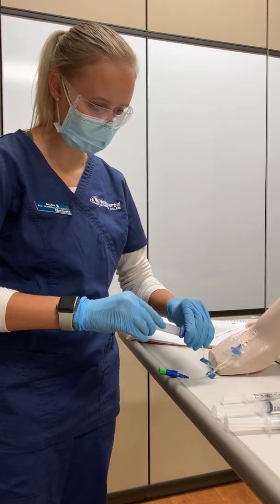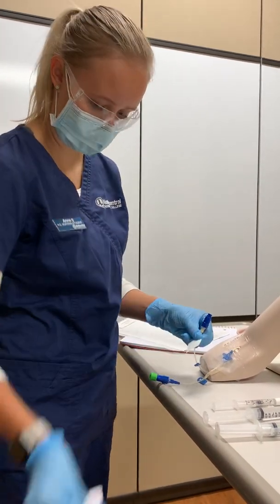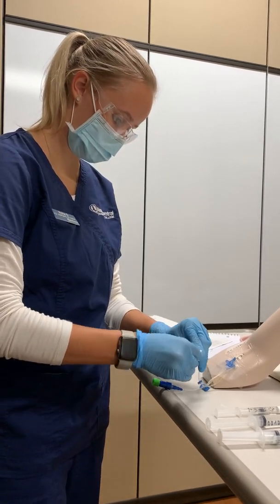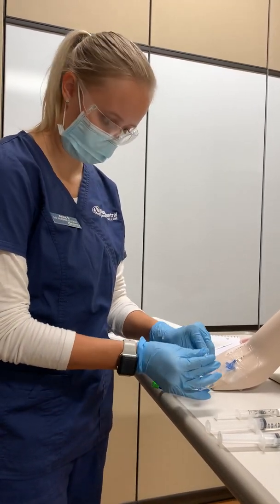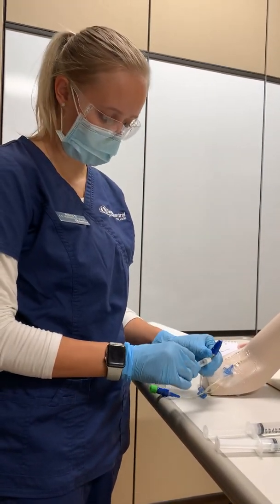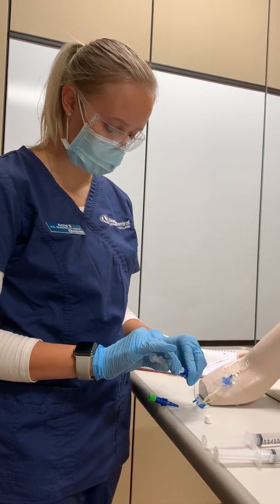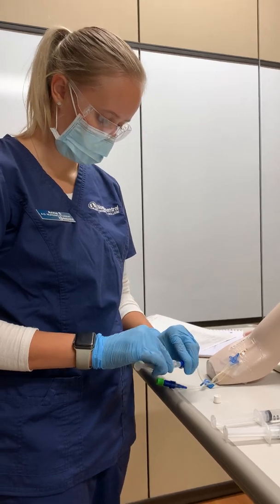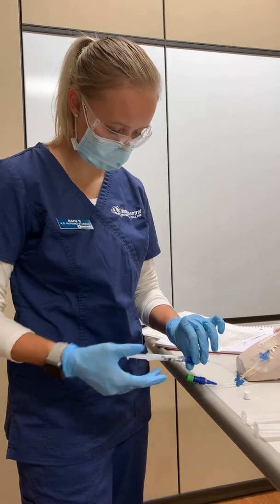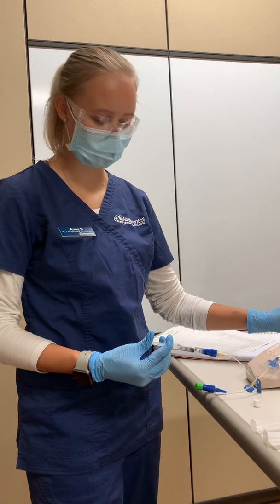Clamp it. Off again. And then according to the drug book, I have to give this medication over 2 to 5 minutes. I would give it over that rate, but for the time, we're just going to give it all.